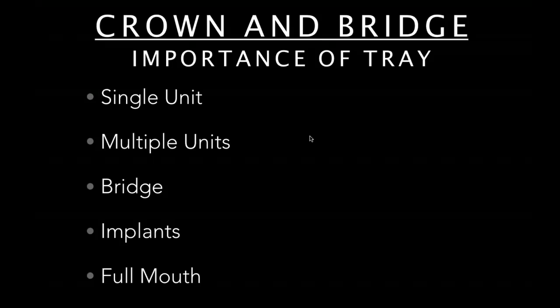So let's look at how important is the tray. The tray is the carrier of the material. And again, if there's a distortion, a lot of times it has to do with the tray. Make sure you have a properly fitted tray. What we do is we actually try the tray in prior to us prepping, because sometimes you need to fit the tray to the mouth. Sometimes you need to put it under warm water and contour the tray.